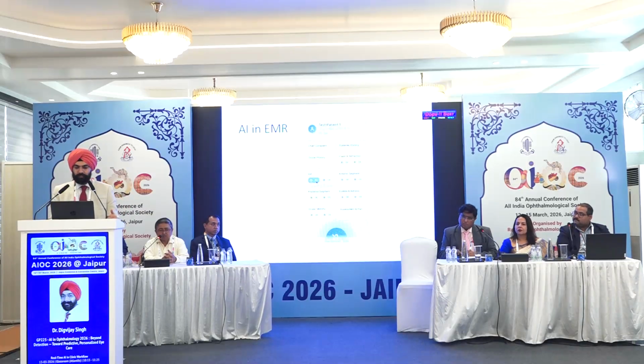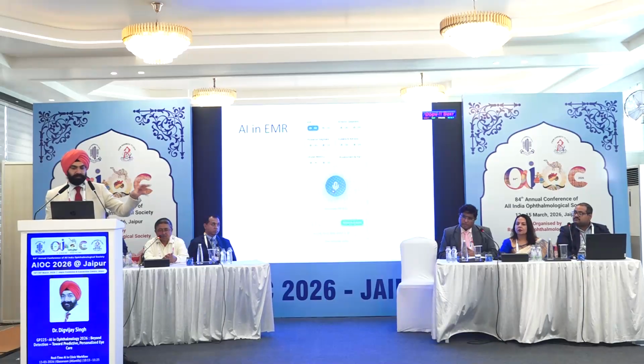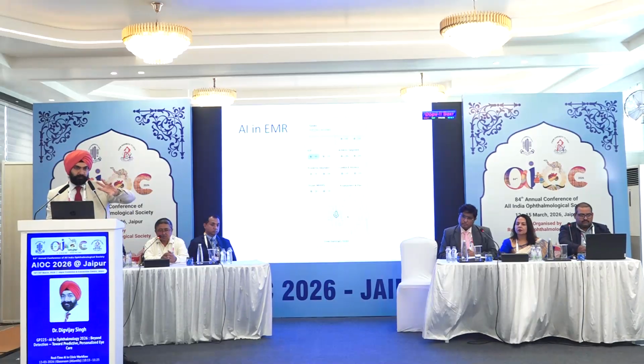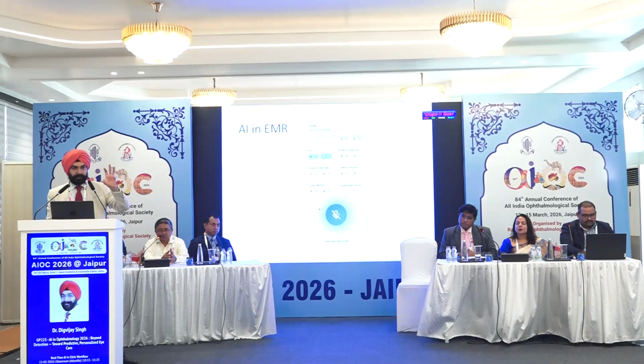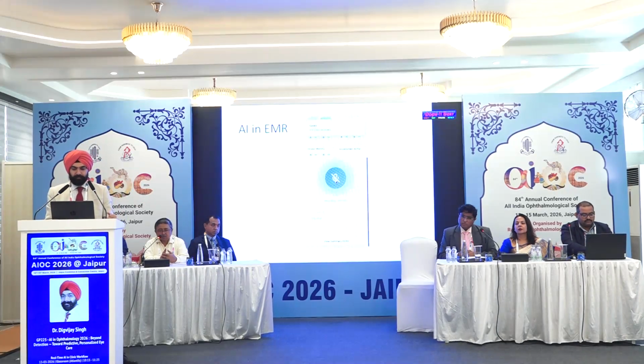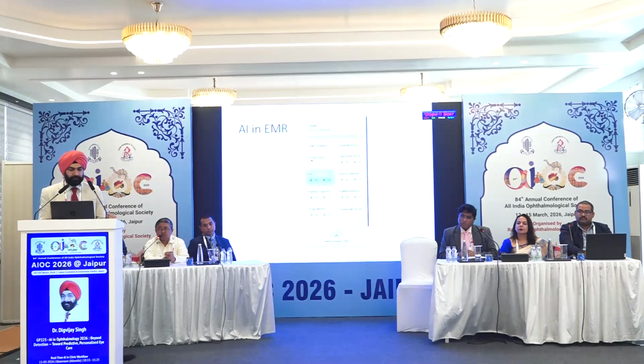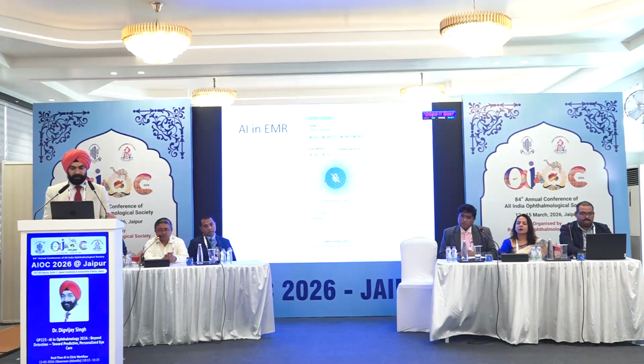This is a software I use which is part of the EMR voice diagnosis. Again, it's AI based. You select a part of the thing, you say what you want to say about it, it will convert into a large language model, and then the LLM will put it back into the software and give you a clinical summary or a clinical report. So this is not yet available commercially outside. This is an alpha version that we are still working on, but it will come out for beta testing.